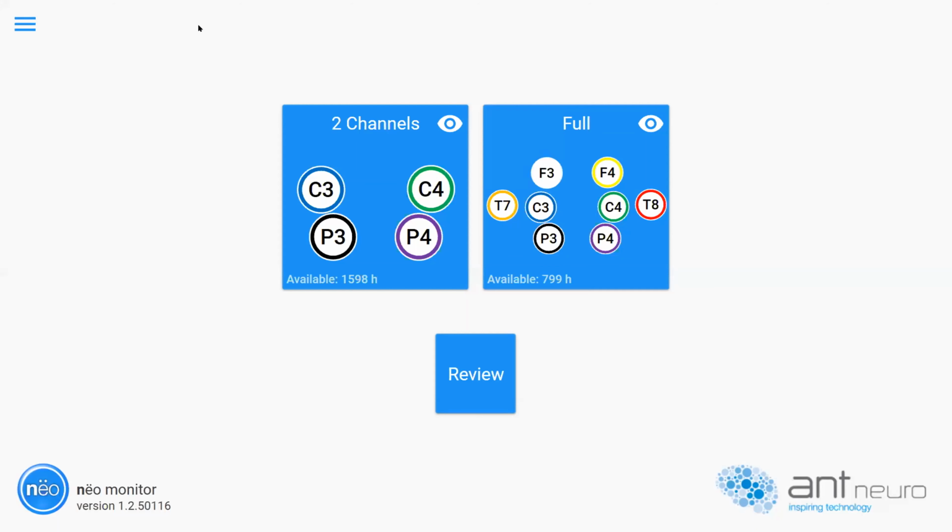Thanks, Greg. As you mentioned, I'll be showing you a live demonstration of the software. This is the start screen that displays the protocols as he had shown. He had an additional protocol on his screen, but as he mentioned, you can customize whichever protocols your NICU uses. Normally, I'd use my finger to select the protocol, but here I'll use a mouse so you can see the cursor. And I'll be selecting the two-channel protocol.